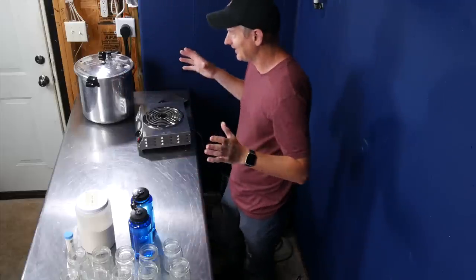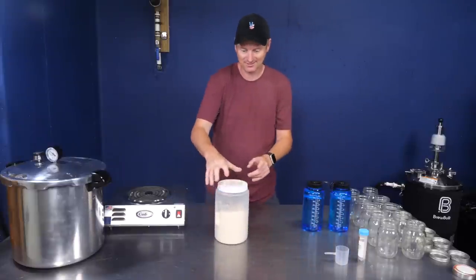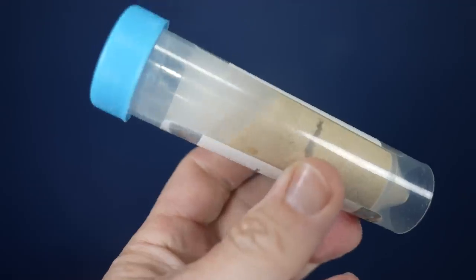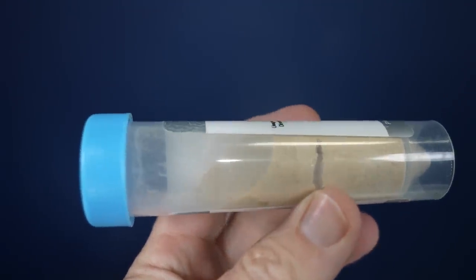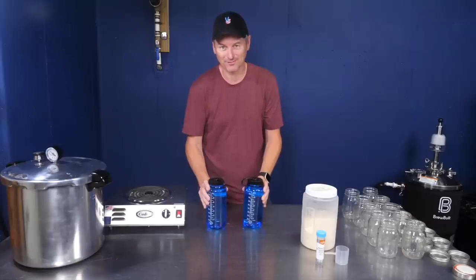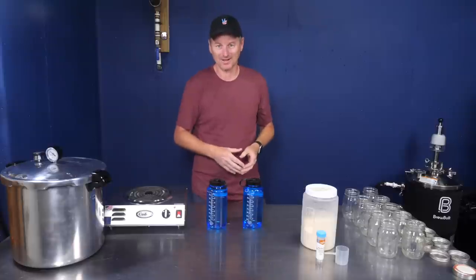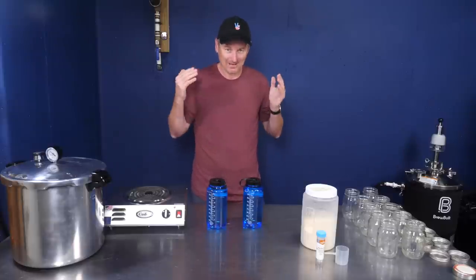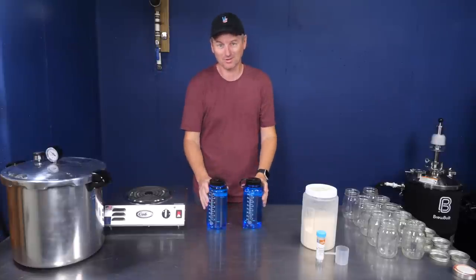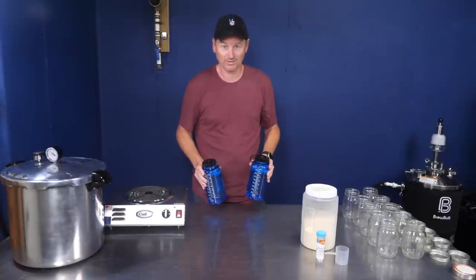Now let's look at the ingredients. We need some DME — dry malt extract — I'm just using light DME. The other thing is some yeast nutrient. And the last ingredient is water. You really want to use a water source that is free of chlorine or chloramines. My tap water has chloramines, so I'm using reverse osmosis water from my RO system. You could use bottled water as well.